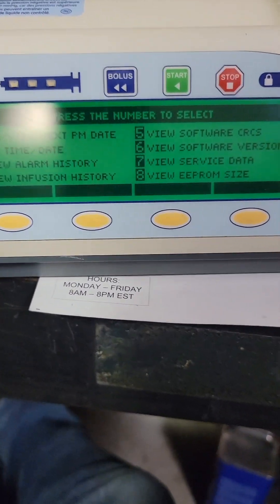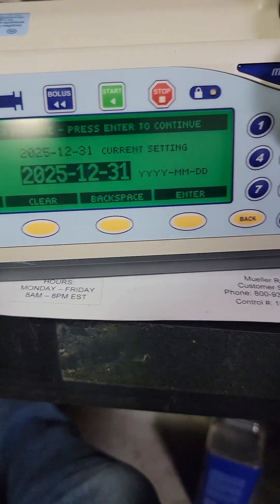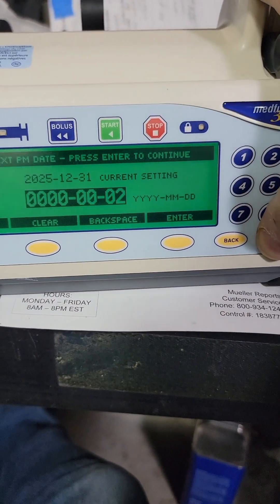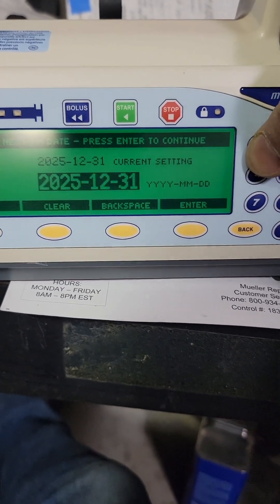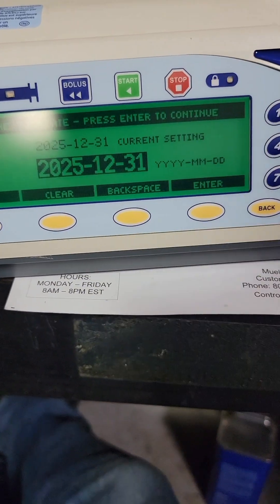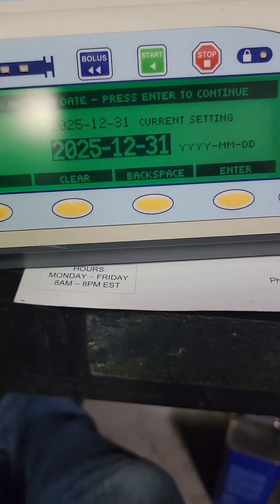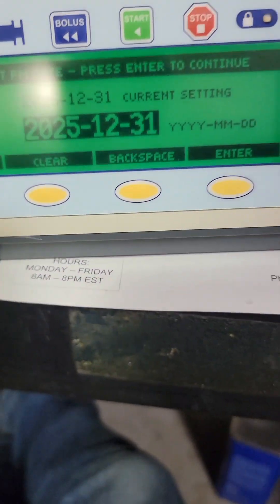When you're entering the date, it goes year first. So you would enter year — like 2, 0 — see how it keeps going left to right — then month, then day. I have it set for New Year's next year. This is not for a hospital setting so it's not really an issue — when we come in to do the PMs, we'll hunt it down and redo it anyway.